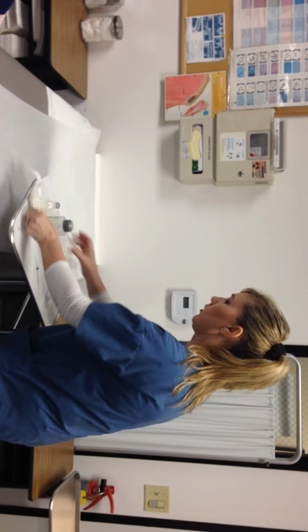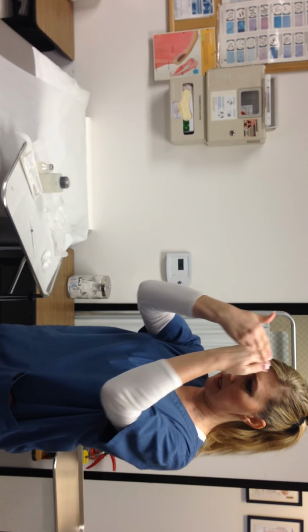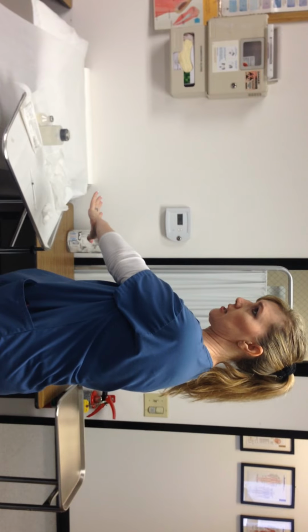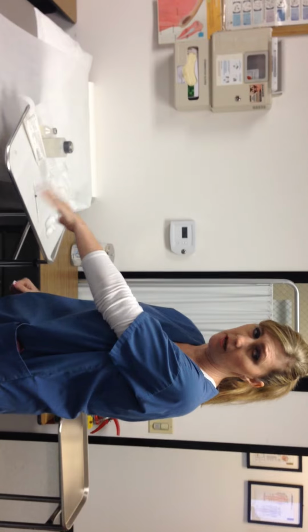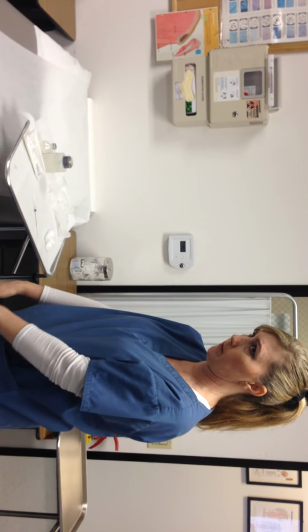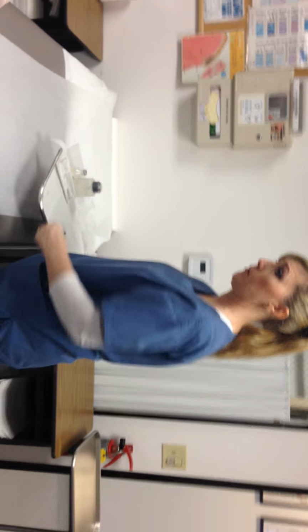Okay? We don't ever cross over the midline of our body. You see the midline? See how it's in the center here? Okay? We never reach over here for something or reach over here for something. That's how you will get stuck. Not a matter of if, it's a matter of when. If you do this, no crossing over. Do not cross the midline of the body. Okay? So I'm right-handed, so my tray is always going to be here on my right.